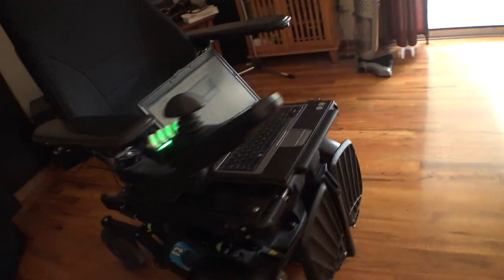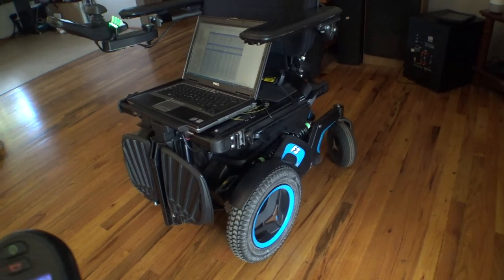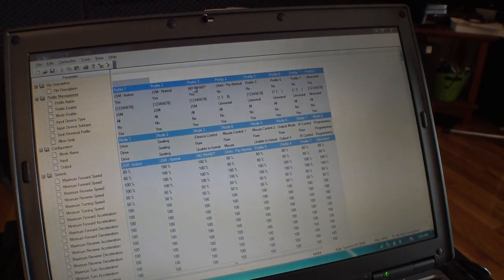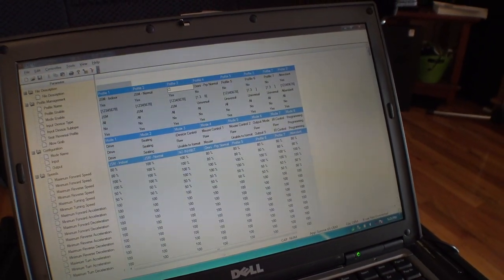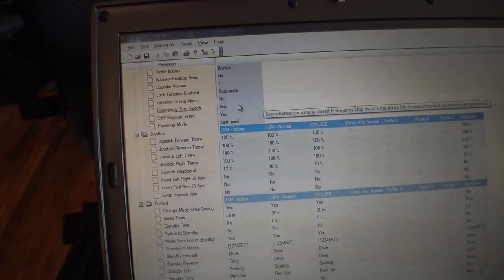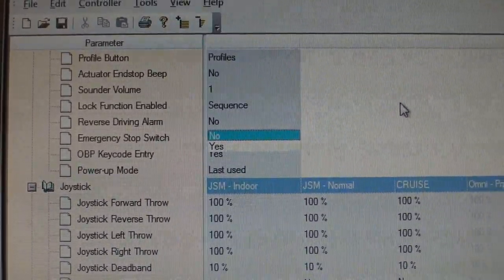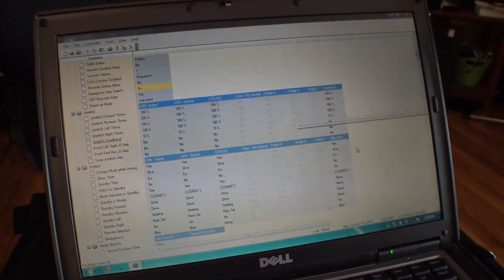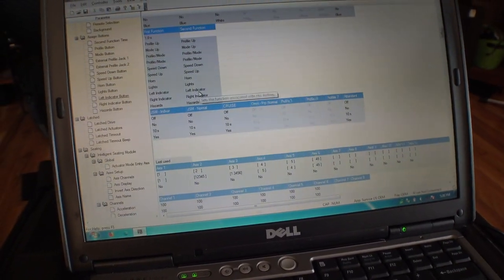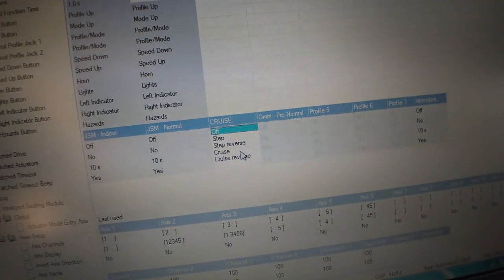Here we have a 2016 F3. We've got our R-Net dongle plugged in and we're going to change a few settings. The key setting you have to change if you want to override using the external switch is one that says 'emergency stop switch' — you have to set that to 'no', which bypasses the requirement to plug in a normally closed switch. Then we scroll down to where latch driving is, which says 'latch drive, set to off', and we pull up the menu to set it to 'cruise'.